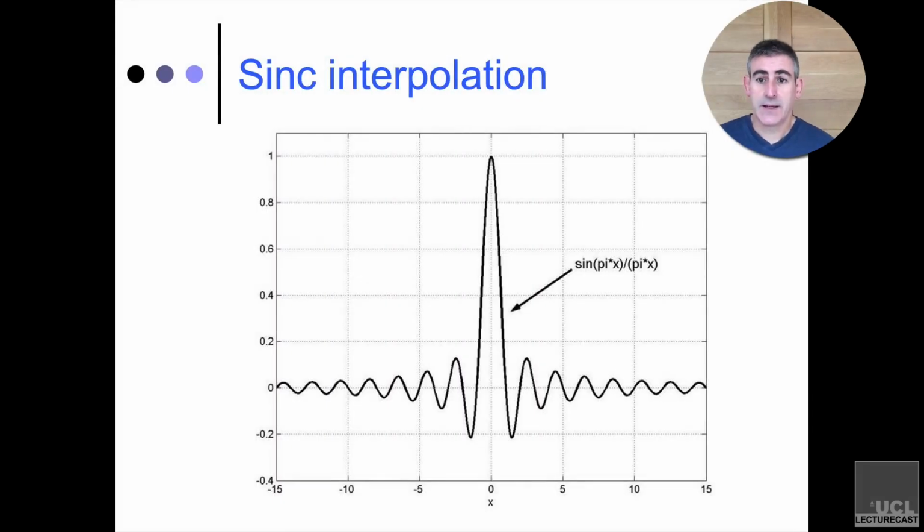There's an even more sophisticated way that's known as sinc interpolation, which uses a much more sophisticated convolution kernel, which is what I'm showing here. But basically, it's a weighted average of the things around it, in this case in one dimension, but you can do it in 2 or 3 dimensions as well. And it has the advantage that it gives you a smoother function, but it also isn't as locally dependent. So that is to say, it's less sensitive to local sources of noise, which is a really important process.